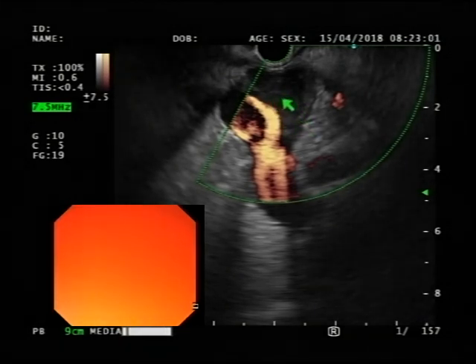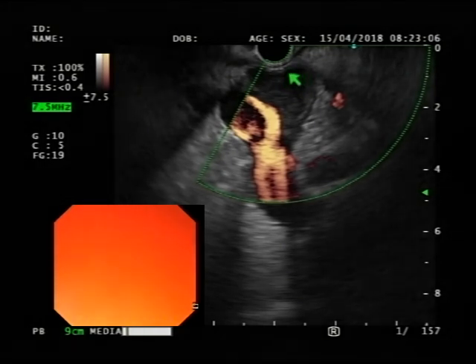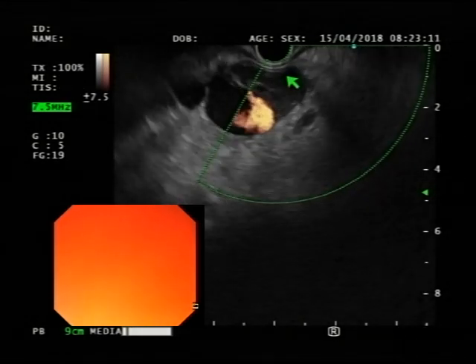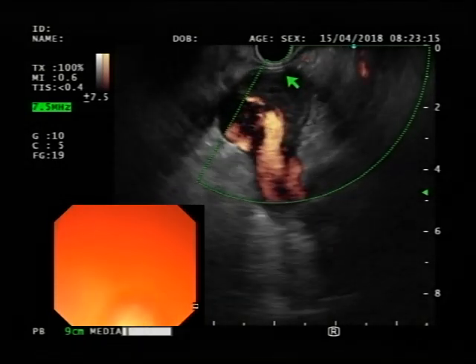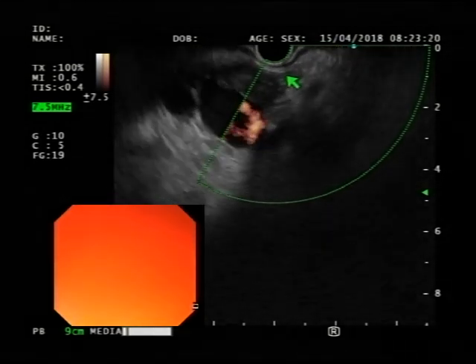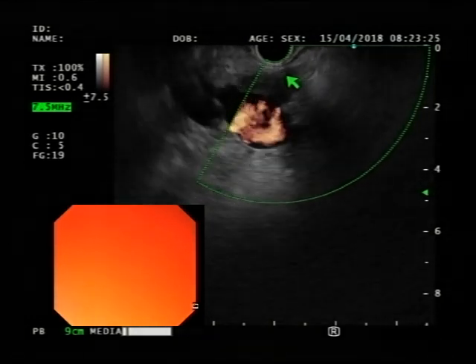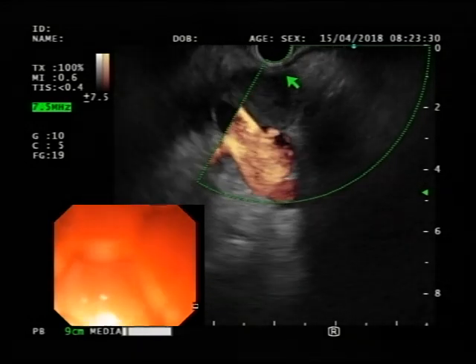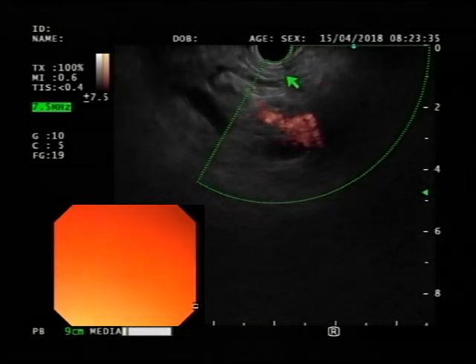Here you see a little whitish tissue in there. Here you see a little more blackish and anechoic area as well. Here it's like a mixed echogenicity, and it's right where the vessels are. And if there was really an actual pancreatic mass, the cancer, not that it cannot be, but mostly you would see a distal pancreatic ductal dilation, which we don't see. We actually are having a hard time finding the whole pancreatic tissue beyond that.